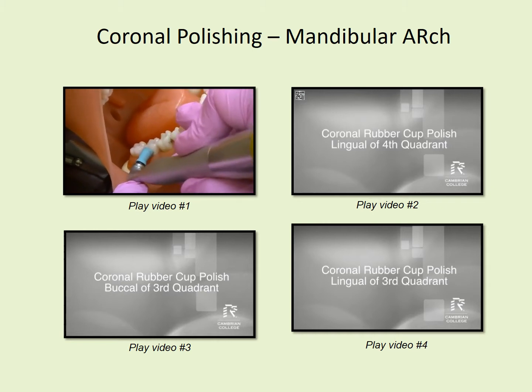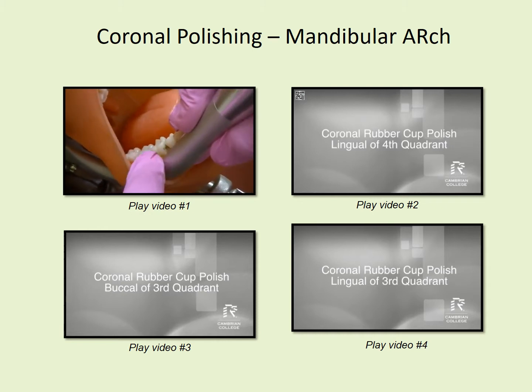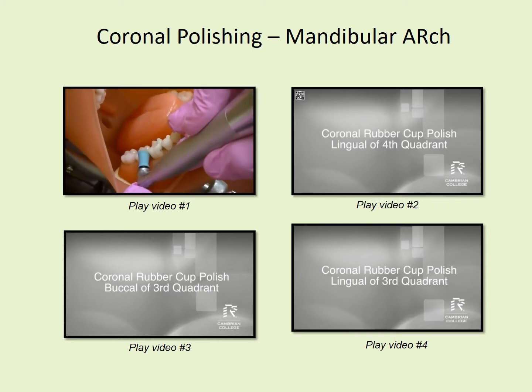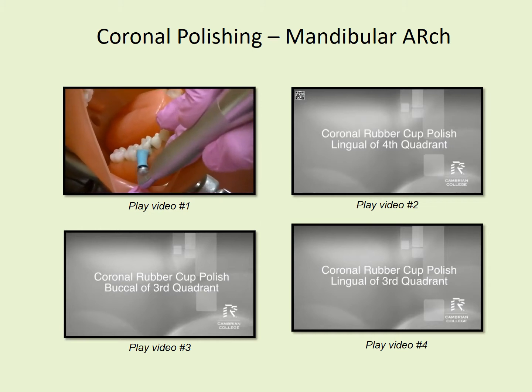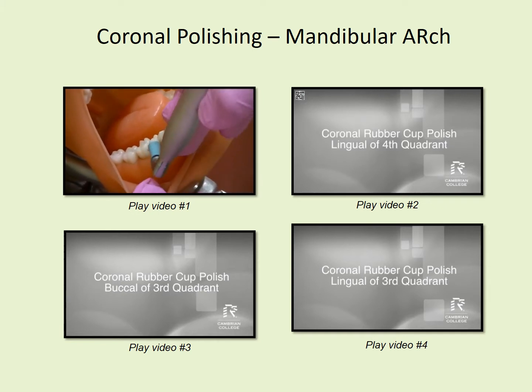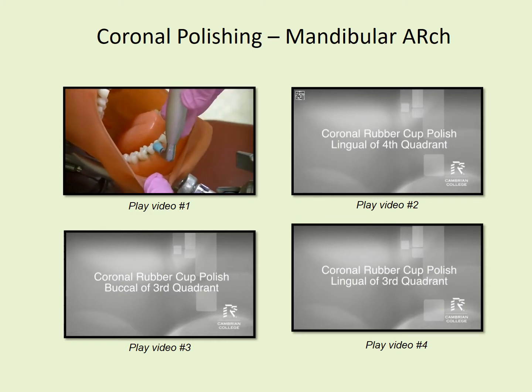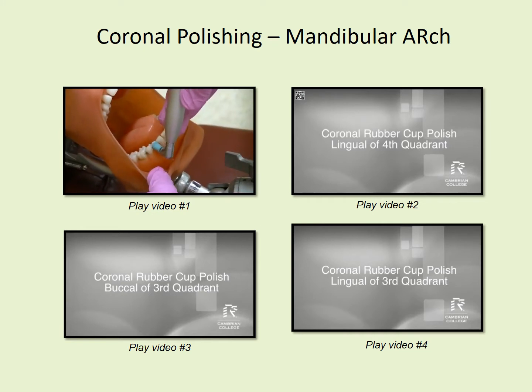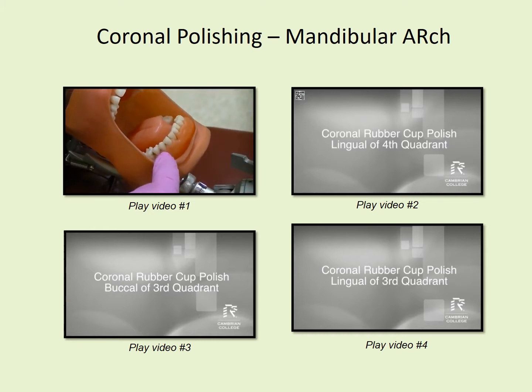Pat, pull, the cup flares on the bottom half. The whole cup isn't on the tooth at the same time. You don't have to use your index finger to retract, but I am for the mannequin in this purpose, just so that I could video better. Pat, pull, pat, pull, pat, pull. And moving across up to and including the premolar area. I'm only demonstrating the gingival third. However, if you need to come up to the incisal third as well, you would do that in another pass.